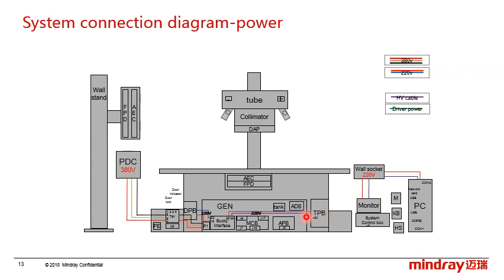And besides, in the equipment room, the PC and monitors are powered by the wall socket. Under the table, the output of the table power box contains 36 volt DC for the electromagnetic brake, and this 24 volt AC is for the collimator light.